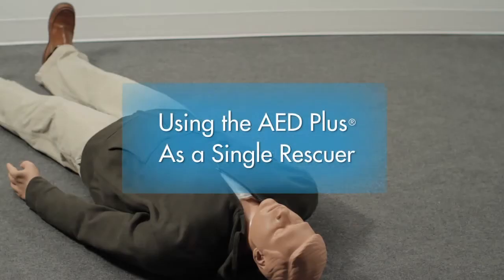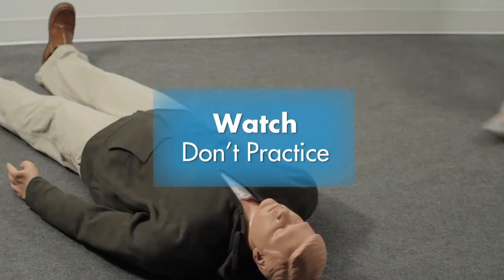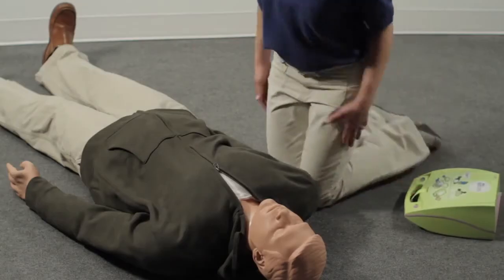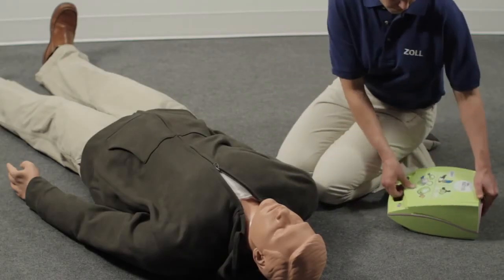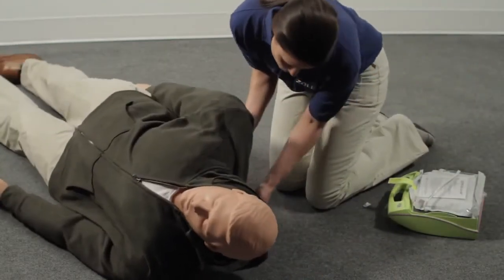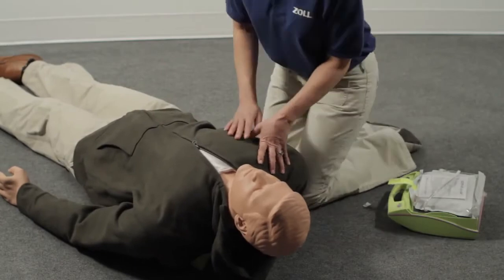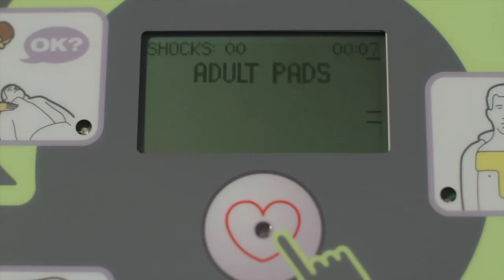Using the AED Plus as a single rescuer: watch, don't practice the following demonstration. Position the person away from contact with water and metal. If the victim's upper body is not injured, use the lid as a support to help keep the airway open — position it between the shoulder blades. Place the AED Plus by the person's shoulder, turn it on, and follow the prompts.